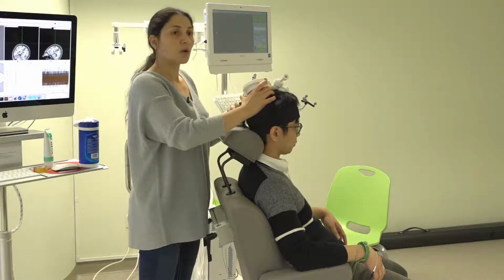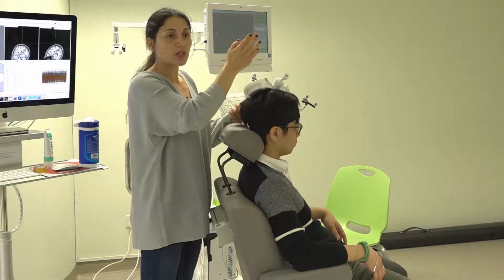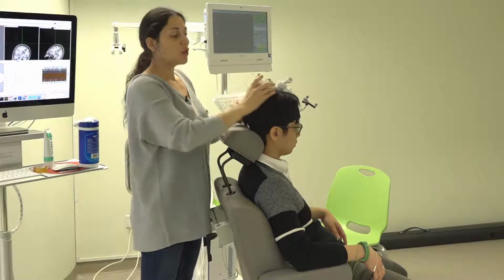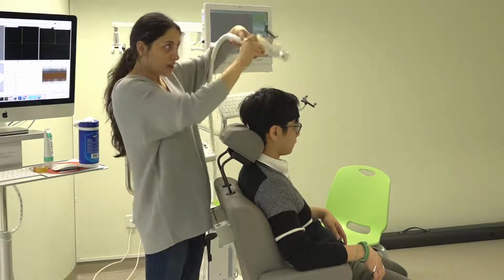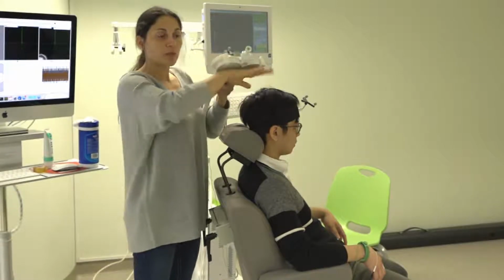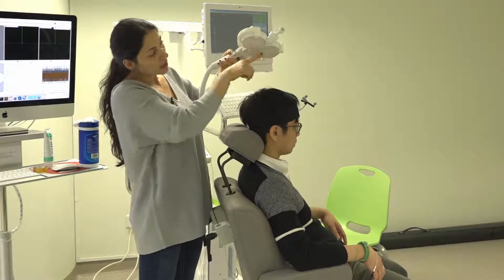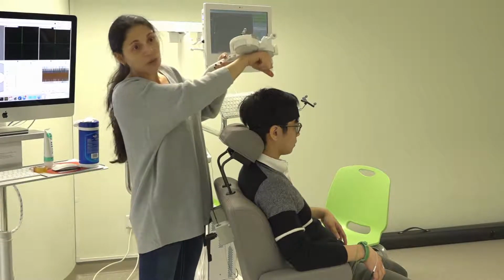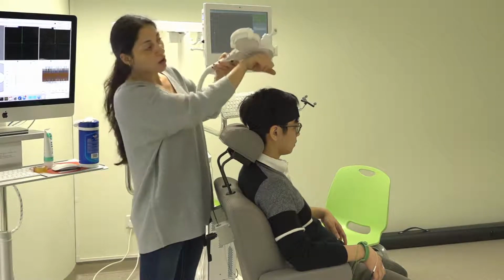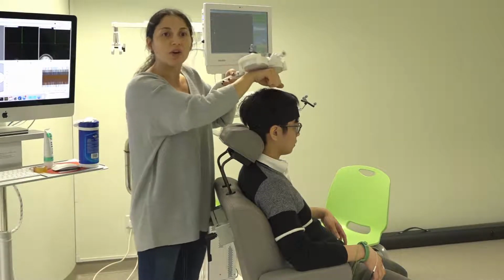The position of the coil should be like 45 degrees. You start with this position, 45 degrees. It should be tangential to the scalp. Not like this, not this. It should be tangential to the scalp. This means this. He has a lot of hair, so you cannot see it. The center of the coil should be over the spot I want to stimulate. Not like this. It should be over the head.